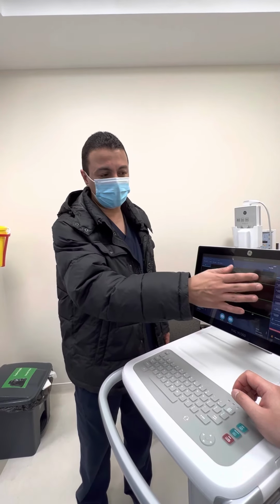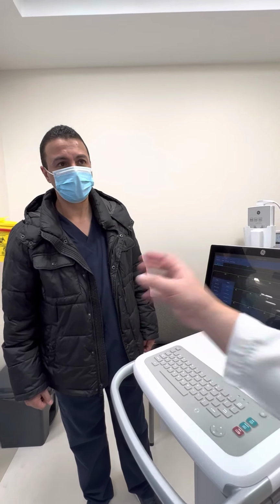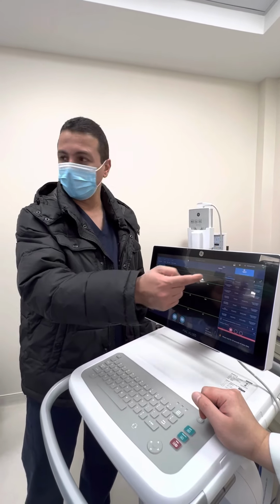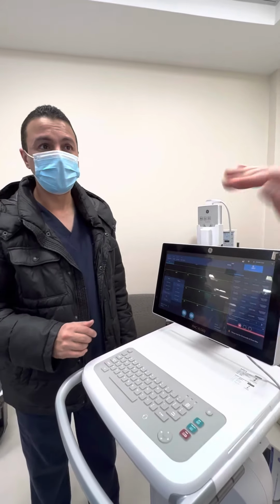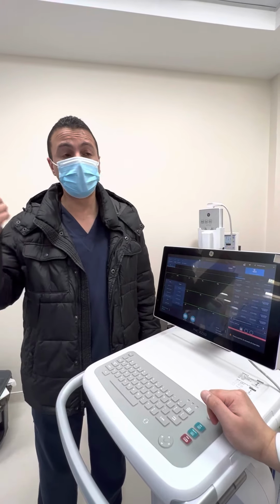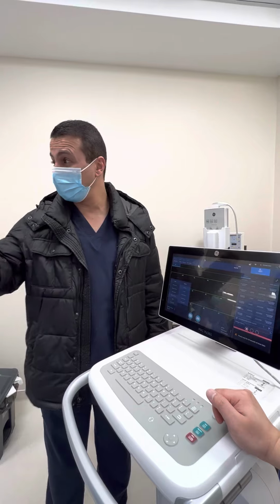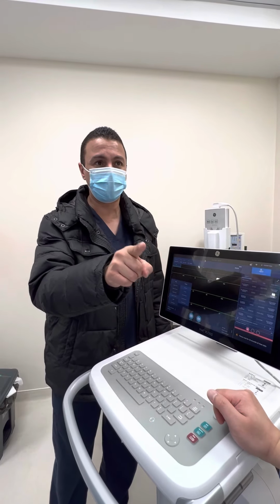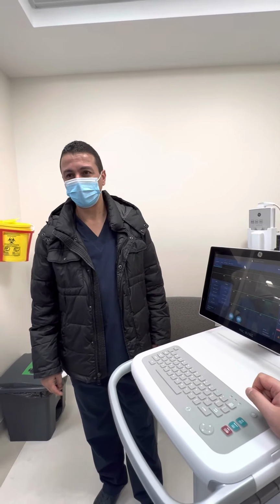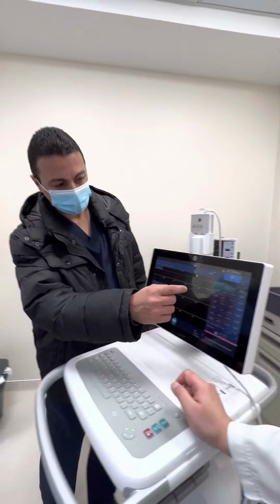Later on you can delete it from the machine. If the file was already opened, can we retrieve that? Yes, exactly. From the files they will be able to find the report, and then no need for edit. She will attach the order. If there is a need to admit the patient, they will place an order for the ECG, even if they acquired the ECG previously. They will get back to the machine, attach to that order, and then transmit. The timing is going to be over here.